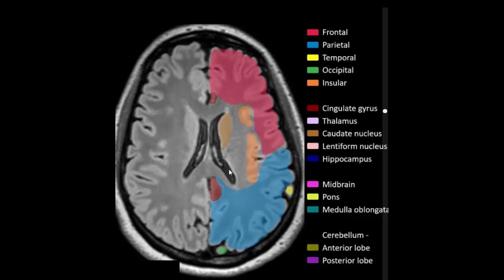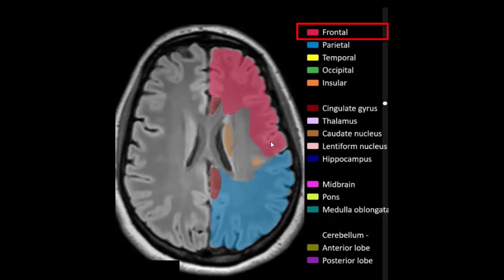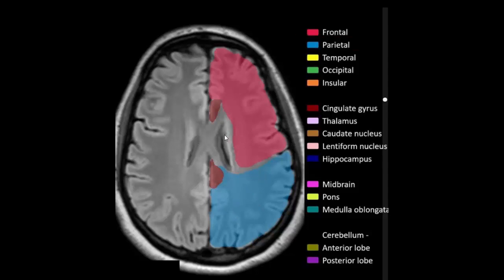Right and left body of lateral ventricle. White matter, gray matter. Frontal lobe, parietal lobe, body of caudate nucleus, cingulate gyrus, insular cortex. Parietal lobe, right and left body of lateral ventricle, cingulate gyrus. White matter, gray matter.